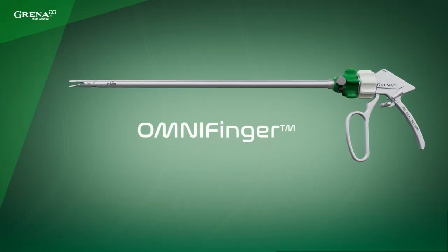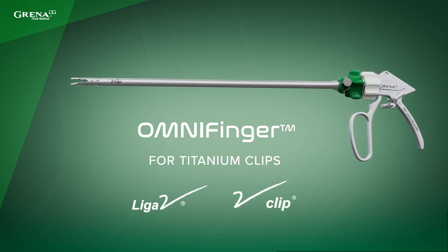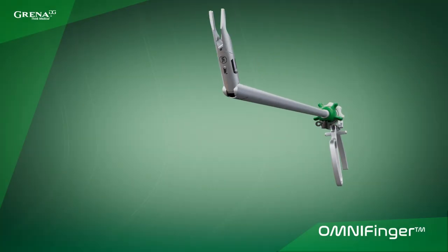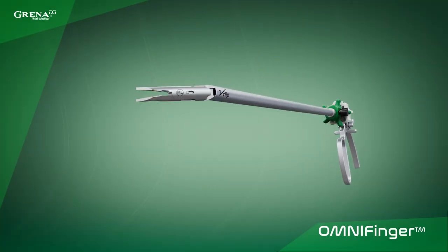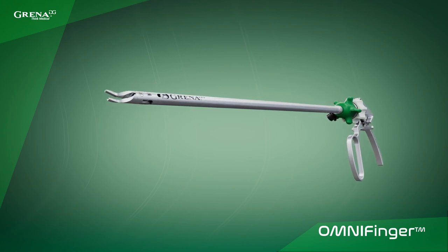This is OmniFinger for titanium clips. It's available in two versions to work with Liga V or V-Clip titanium ligating clips. Thanks to 3-axis jaw rotation, this innovative articulating clip applier makes difficult medical procedures easier than ever before.